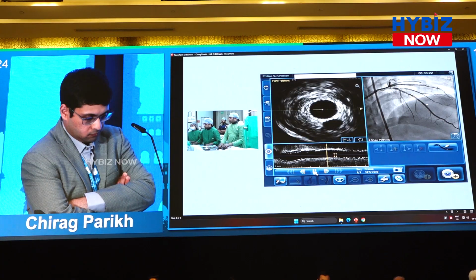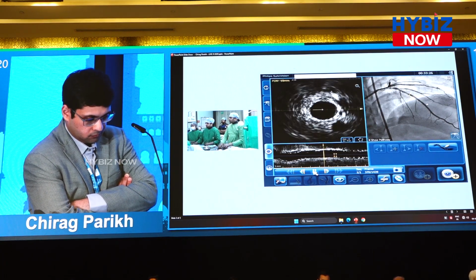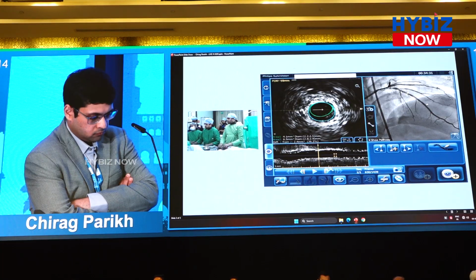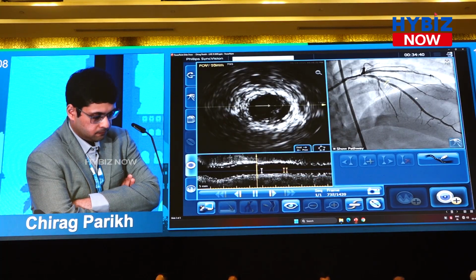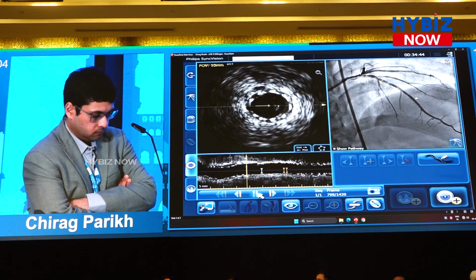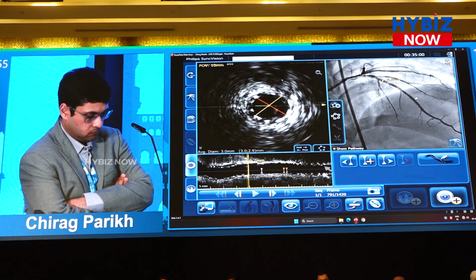And here you can now very beautifully co-register the images with the angiography, where the diameter is around 3. So considering that he had a 3.0 stent, he has actually received an adequately sized stent. And here we can see that there is a lot of lipidic areas inside this, probably there is a plaque rupture, which probably represents why he had an acute coronary syndrome. And the previously deployed stent is quite well expanded. It's a 3.0 stent, which is expanded to 3 millimeters.